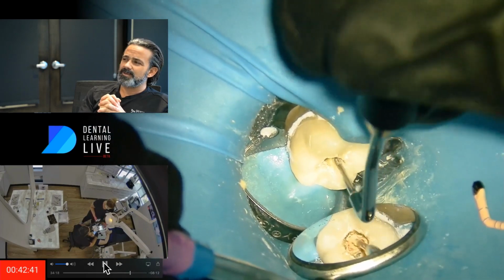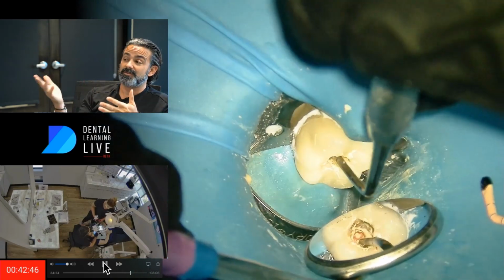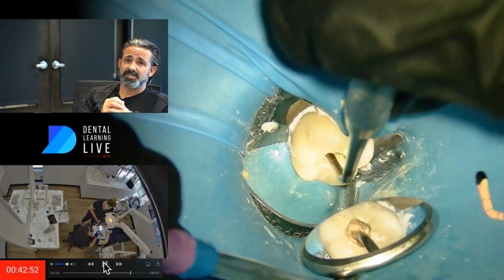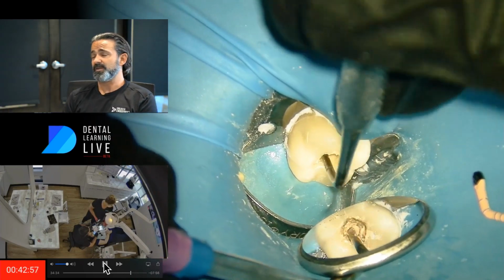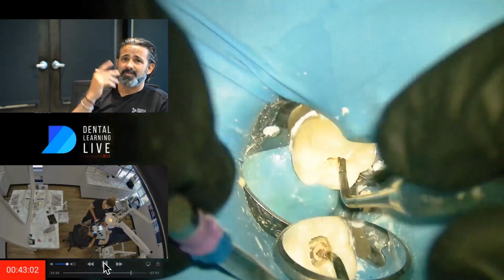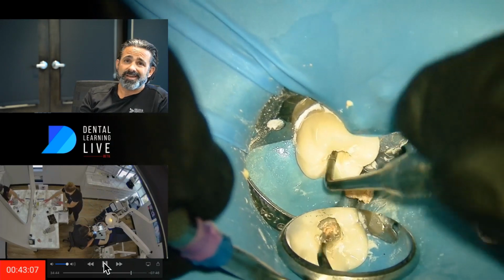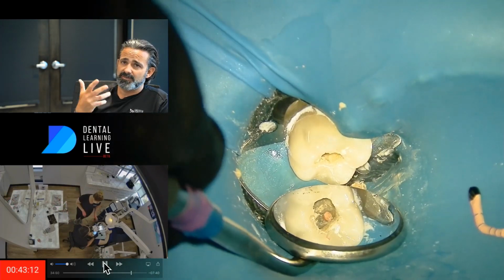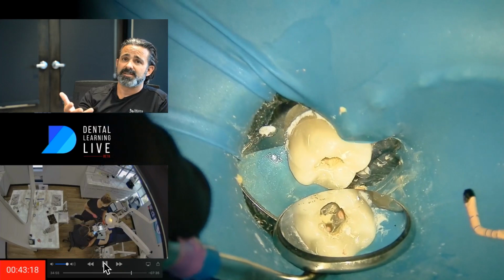It gets a little bit messy at times like this. You can see sealer and gutta percha. Even if we are doing a restoration, I like to clean that up at the end. I think we're oftentimes judged by what the presence is when another doctor goes in. If your referring doctor is doing the filling, I like to really clean this up. I don't leave gutta percha smeared under a pulp horn or sealer somewhere, which affects his bond. I'll even scrub it clean with a conditioning agent or alcohol or whatever it takes when I'm punting this back to my referring doctor.